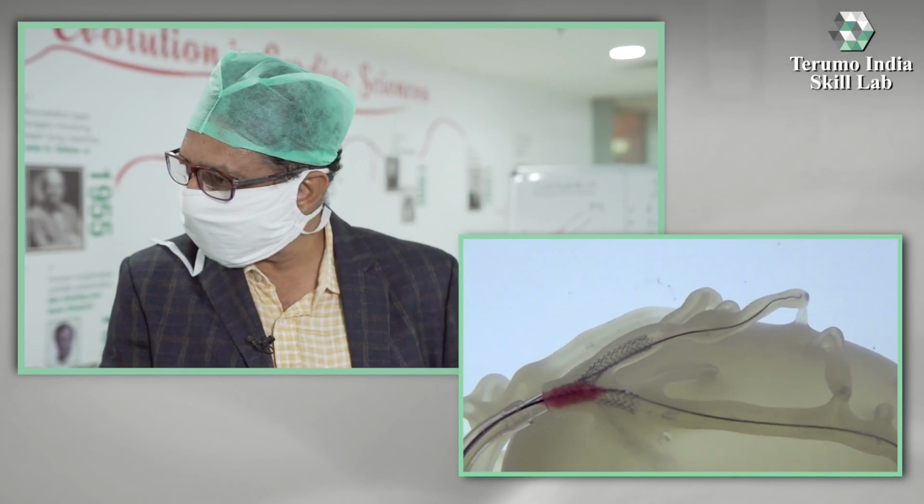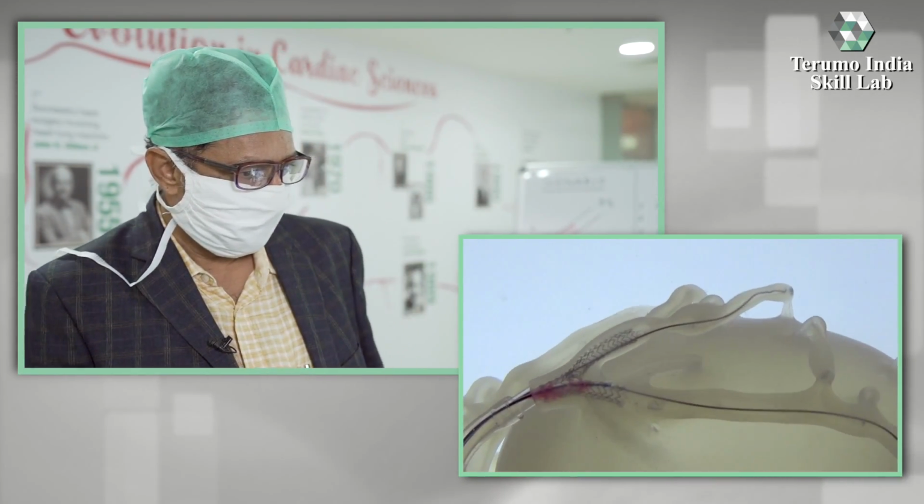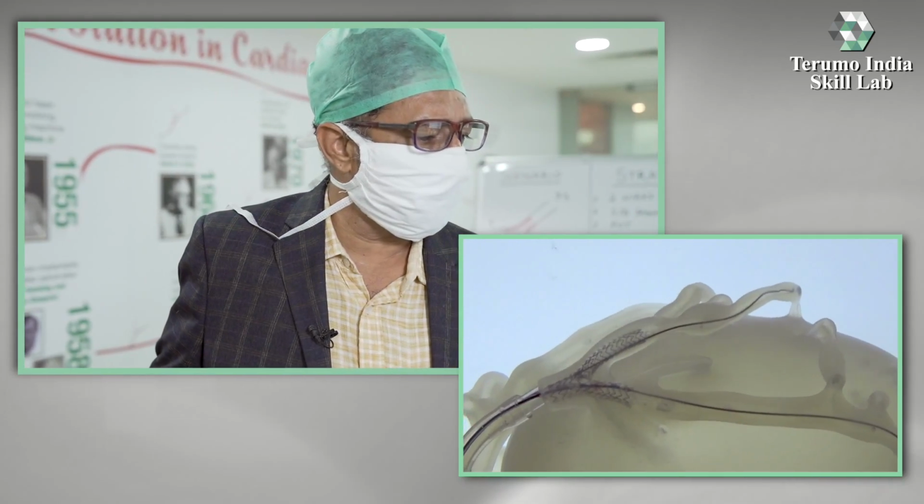So your side branch ostium is again okay. So that's how it is. So I think the procedure is complete.